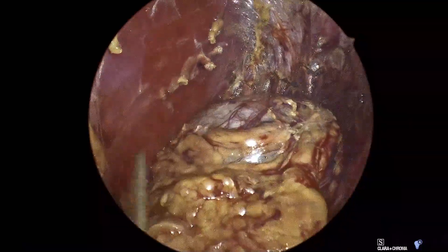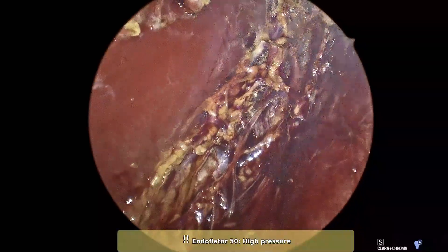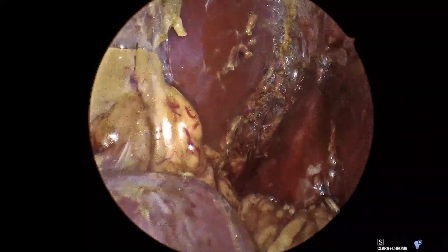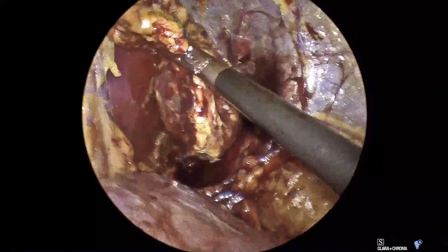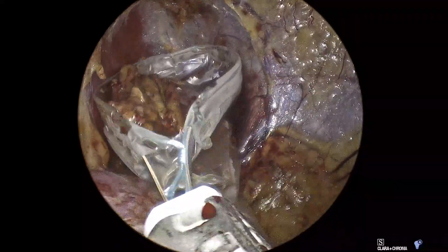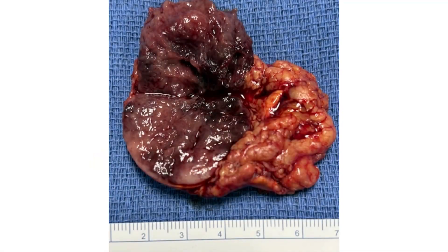Once the tumor is freed from all the attachments, I remove it. Now releasing the retroperitoneal pressure to expand the IVC to ensure that there's no bleeding coming from the IVC — and as you can see, it's completely dry. The adrenal gland is placed in an endoscopic retrieval bag to prevent tumor spillage. The specimen is extracted through the initial incision, which may be slightly enlarged if necessary. You can see the gross pathology here. Thank you again for watching.